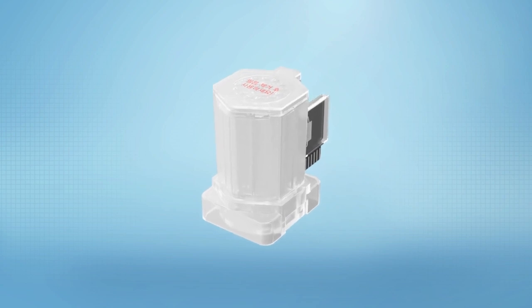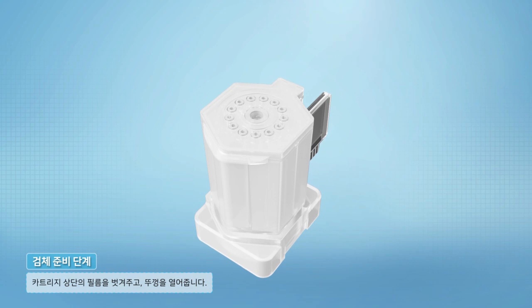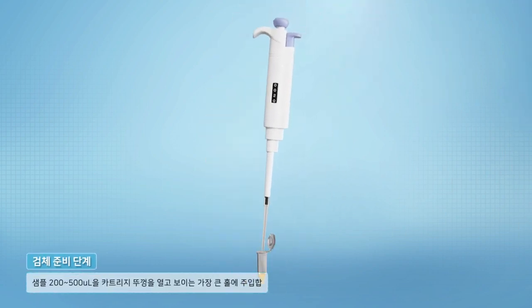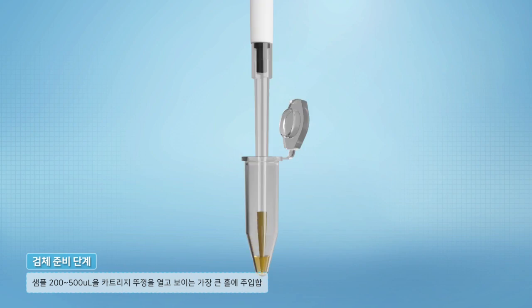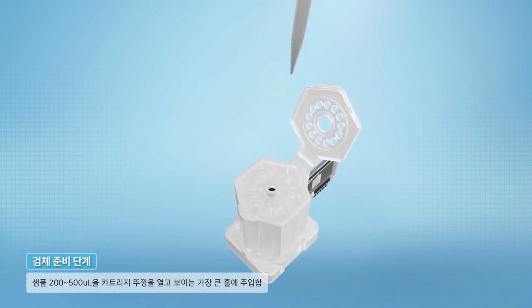Dedicated cartridges are used for testing. First, sample preparation. Peel off the film on the top of the cartridge and open the lid. Inject 200 to 500 microliters of the sample into the largest hole of the open cartridge. Now the sample preparation is complete.